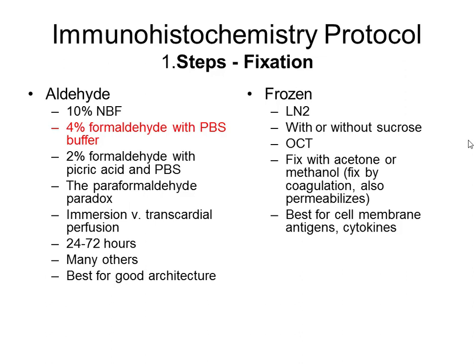So when we use fixation in formaldehyde, we must put the sample of tissue into the formaldehyde for 24-72 hours. The duration of the fixation procedure is connected with the tissue properties and also with the size of the sample.